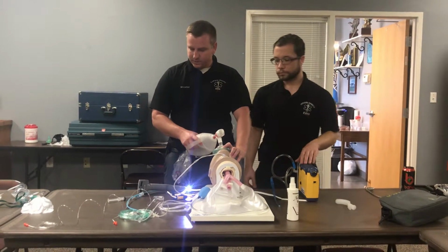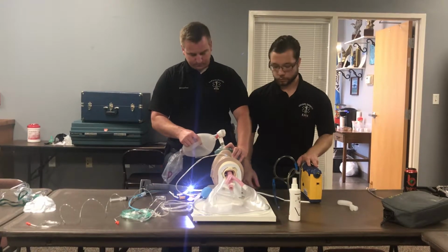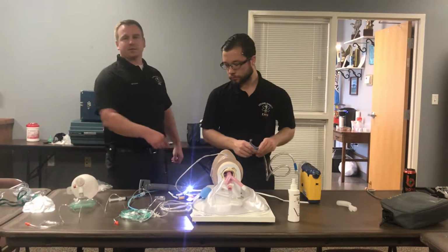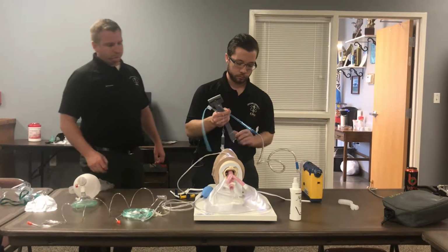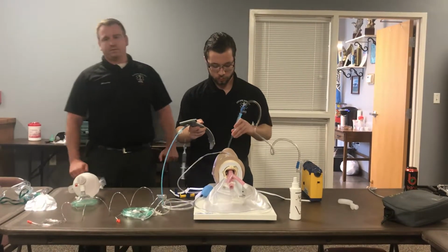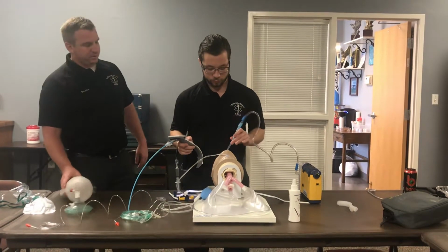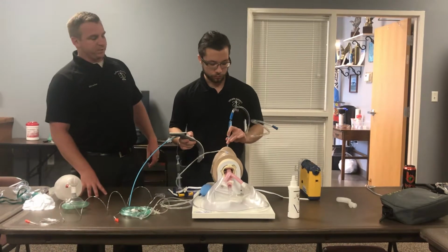So when Levi is ready, he's going to tell me, and I'm going to move and take the OPA out. All right, I'm ready. Take the OPA out. We're going to leave the nasal cannula in place. So he's suctioning first. No matter what, he's going to suction every single airway he encounters, because the last thing he wants to do is put that video laryngoscope down into a bunch of blood or vomit.